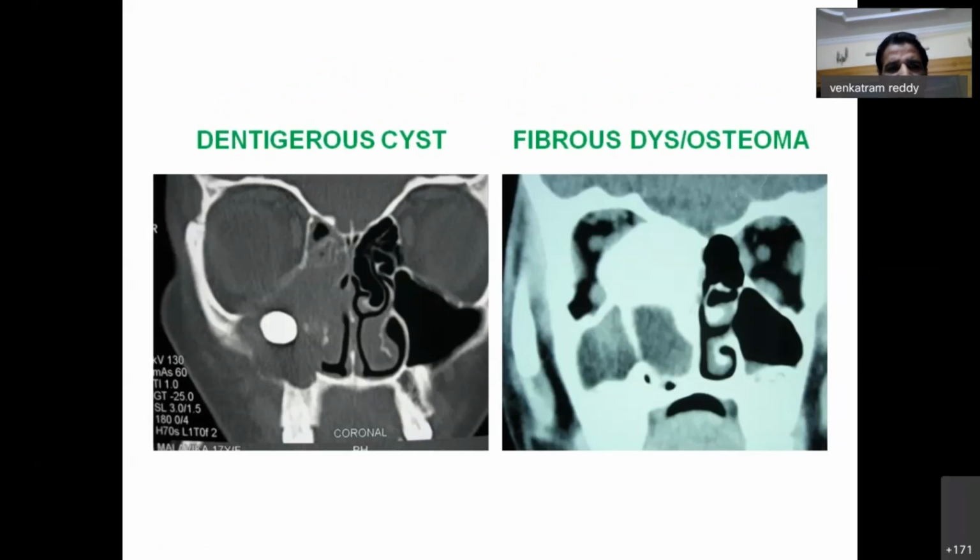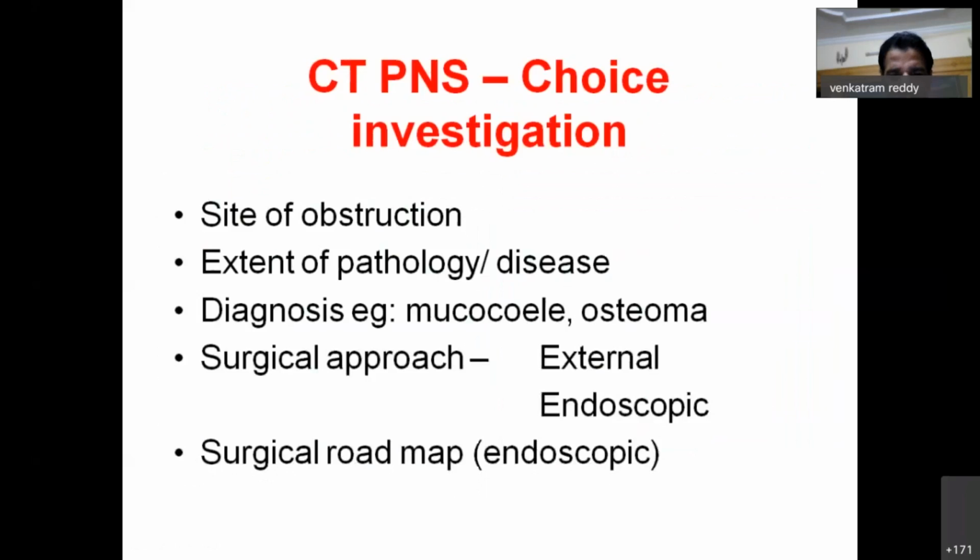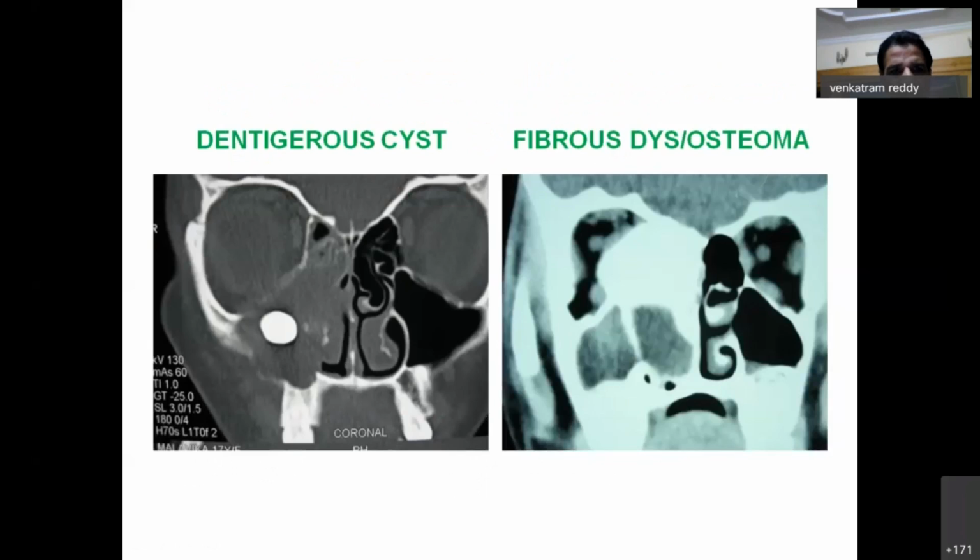You can go ahead. Now, see, this I told you, it gives the diagnosis straight away. Look at this: a bony cyst or a fibrous dysplasia involving the ethmoid on this side. So, looking at this CT scan, we can come to a diagnosis straight away in the case of fibrous dysplasia. That's the beauty of the CT scan, wherein you can spot a diagnosis immediately, and your diagnostic endoscopy may not give any diagnosis.